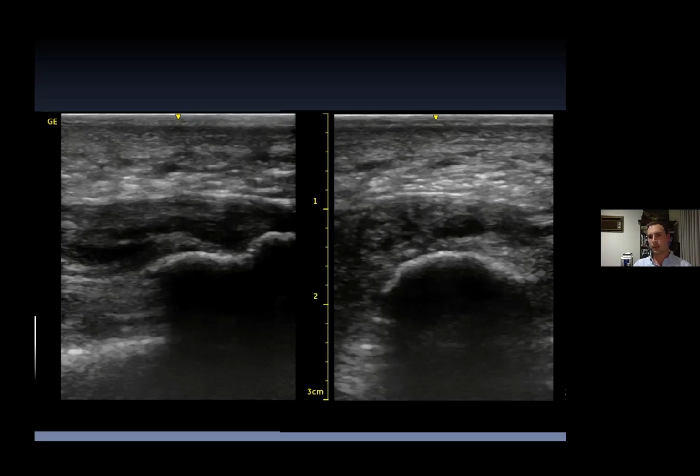There are many patients with tendons that run within a sheath, like your peroneals, your tib post, tibialis posterior tendon. If it's through the midpoint of the tendon and you've got a split there, I don't think shockwave has a heap of success. I've treated patients over the past and I would say mixed results. It generally works reliably on those big, strong, powerful tendons and fascia. That's what it works very well for.